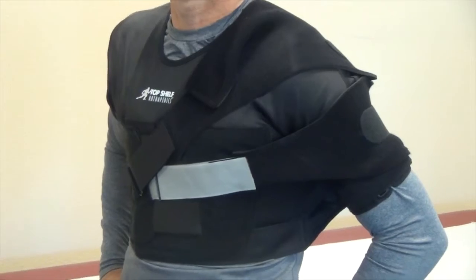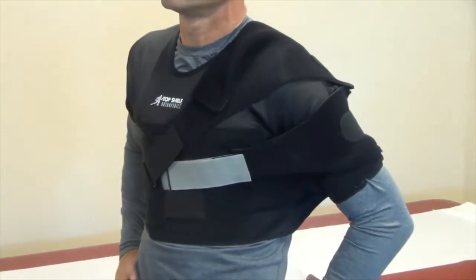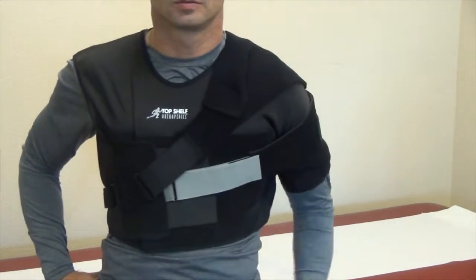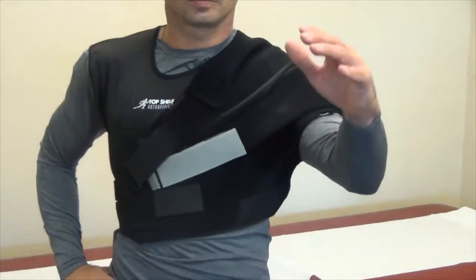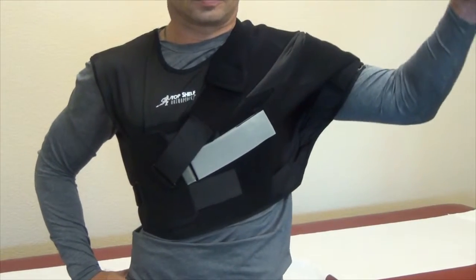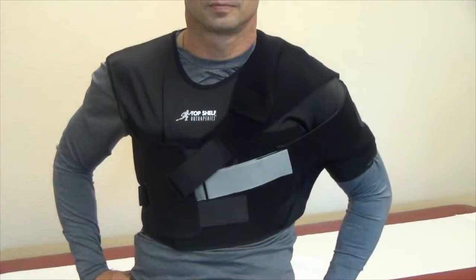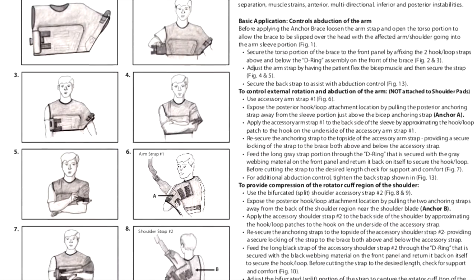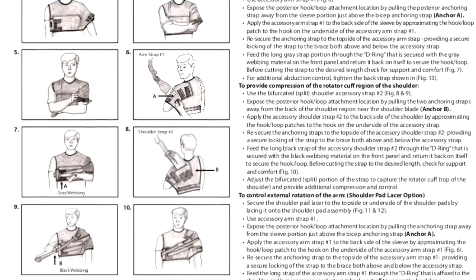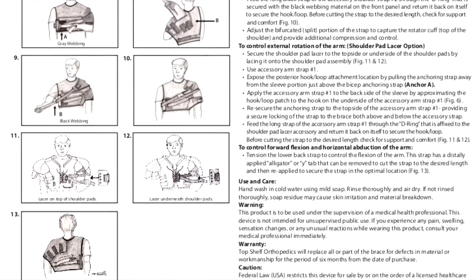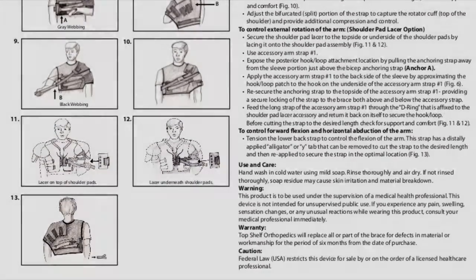Demonstrated here is a properly applied Anker Shoulder Stabilizer Brace, showing abduction control as well as external rotation and forward flexion control. For additional instructions and to familiarize yourself with the application and care of the product, you can reference the directions for use included with this brace.